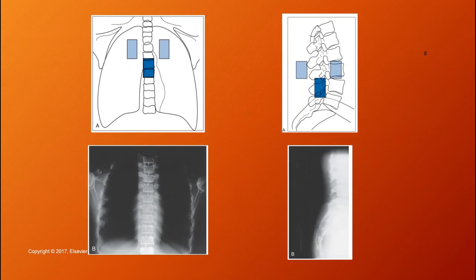All right, here are some examples. On the left is a lung x-ray used on an AEC, I assume wall bucky, of course. And they are using the center cell instead of the 2 lateral cells over the lung fields. And as a result, a lot of radiation had to penetrate through that spine to hit the center cell enough where it tripped the exposure to terminate.